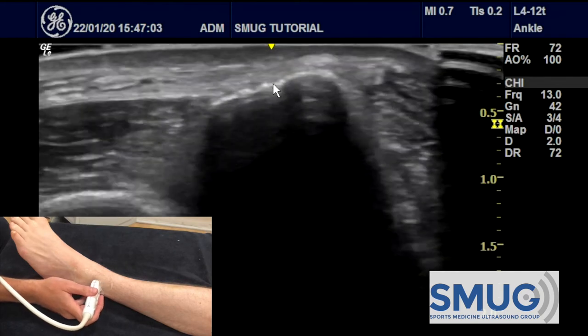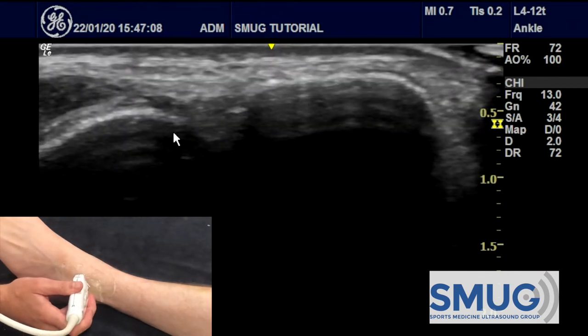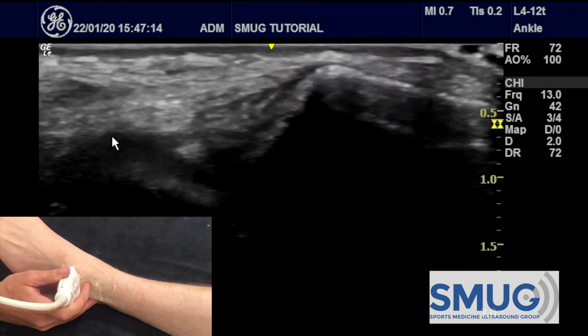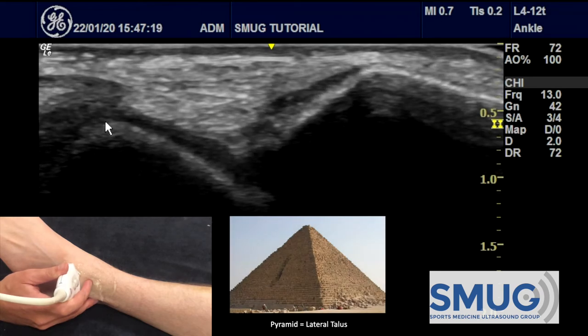As you move down distally, you see the tibia and the fibula coming close together, and as we slide off the distal end of the tibia, we start to see the lateral talus. You know it's the talus because it's got articular cartilage on it. This is now in the shape of a pyramid, so the talus is in the shape of a pyramid.